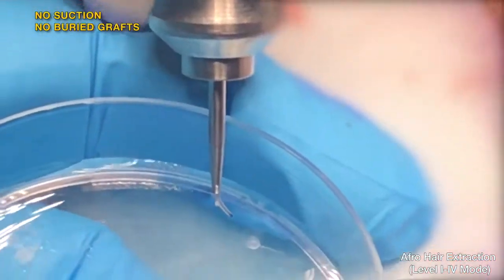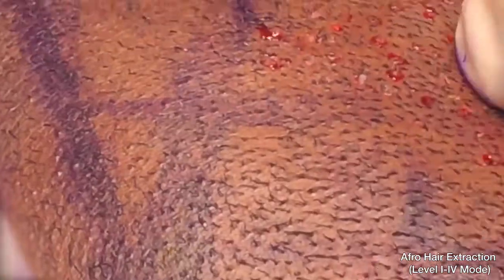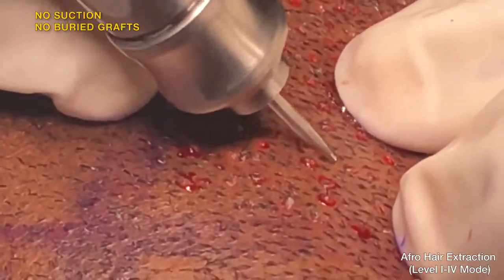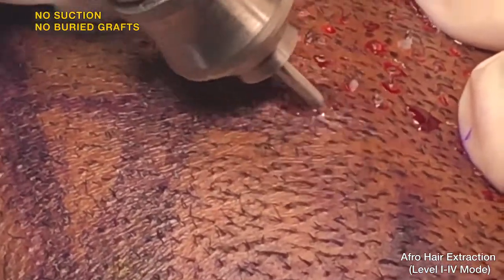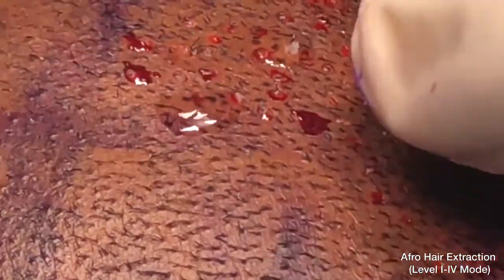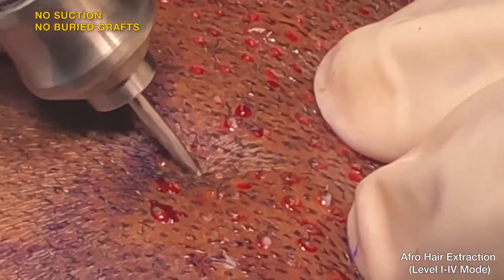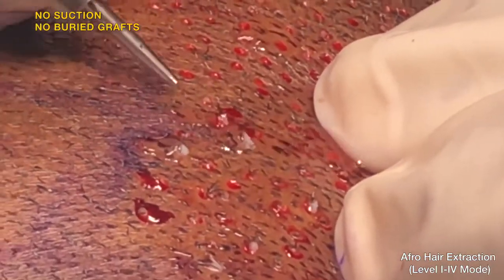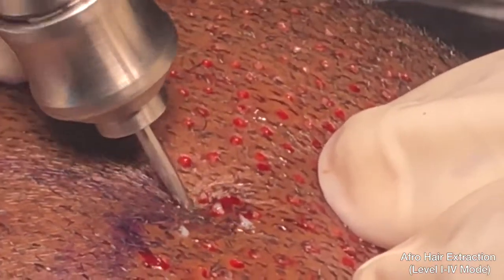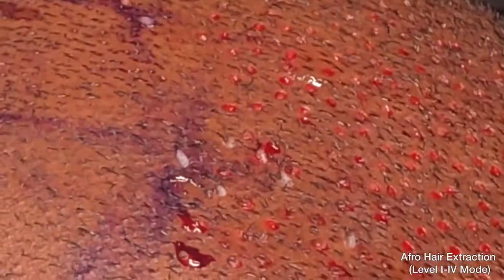The graft comes out intact because of the pulling effect of the intelligent design of the Dr. U Graft punch. Another very important advantage of the pulling effect is that there are no buried grafts. All this together aids in getting better graft survival and regrowth for a happier patient and doctor.